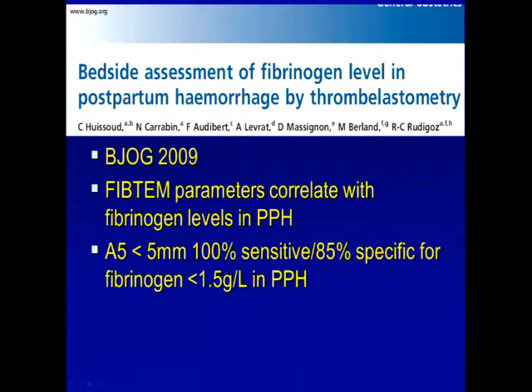Do you foresee us going to using this for patients in the community on warfarin, for warfarin monitoring? And INR just disappearing completely? I don't think so, because at this point the INR is a cheaper test if you look at it individually, and it was actually designed specifically for that reason. So it is a reasonable test. It depends on what it comes down to in terms of cost. Some of the UK data shows that an entire coag panel, so INR, PTT, and maybe a fibrinogen level, costs about the same as the reagent to run one ROTEM. If you don't account for the cost of the machines, that upfront cost, the cost of the reagents to do one test is roughly equivalent.